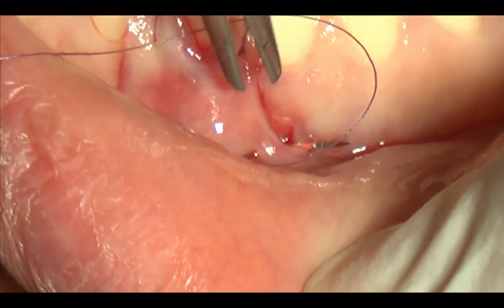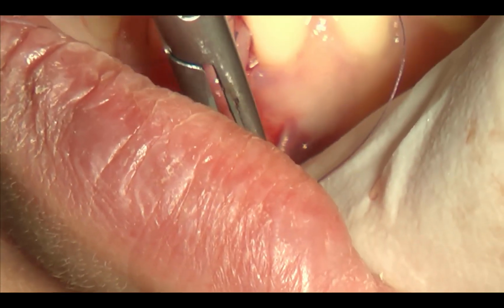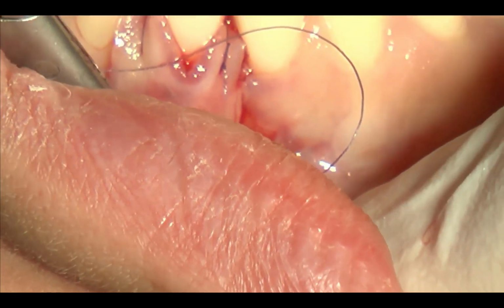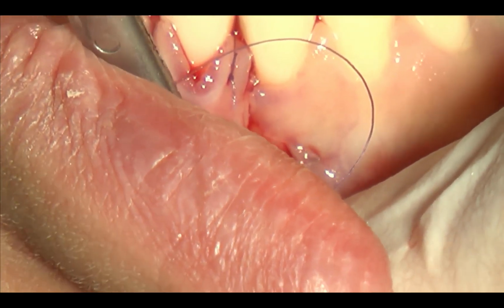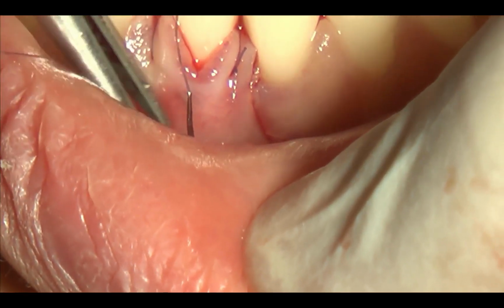adjacent soft tissue. No. Così no. Così? No. Non c'è, come bisogna basta tirare un pelo poi. Aspetta un secondo. Aiutami un po' dall'altro lato, dai.